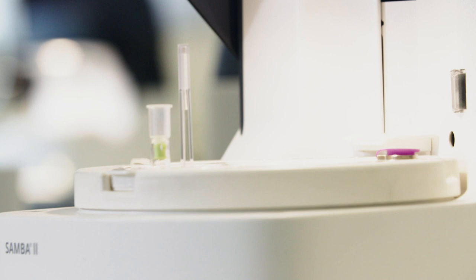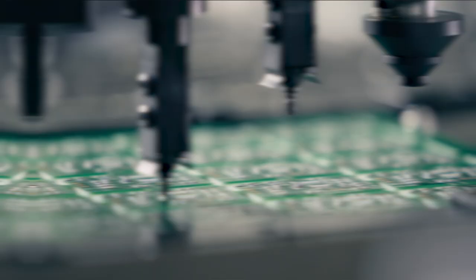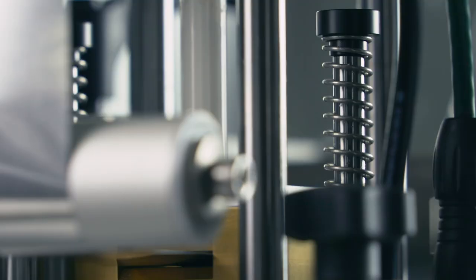Could this little device be the game changer in the detection of the coronavirus? Helen Lee and her team from Diagnostics for the Real World in Cambridge designed this diagnostic device especially for developing countries to help them detect HIV under often difficult conditions.